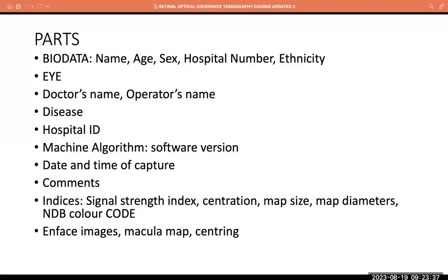In the first person, you say, oh, this could be Berlin's edema. Let's just confirm. So you have a pre-investigation diagnosis. So let me put, next slide.